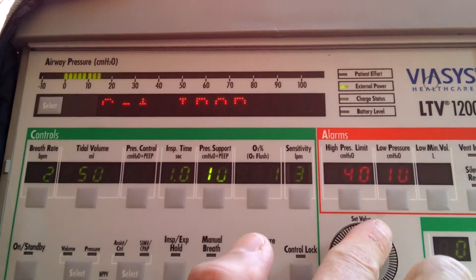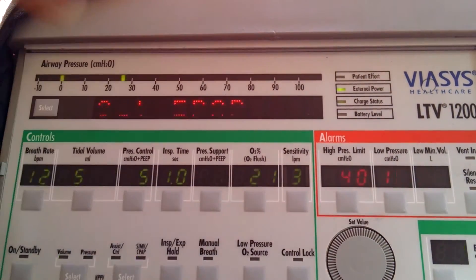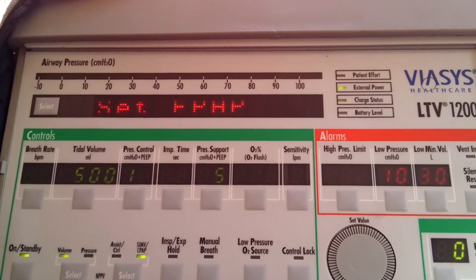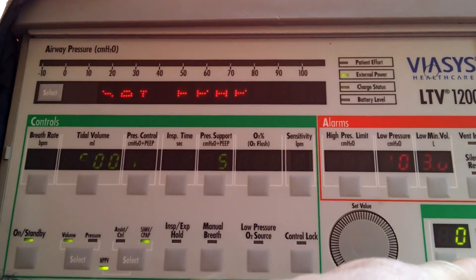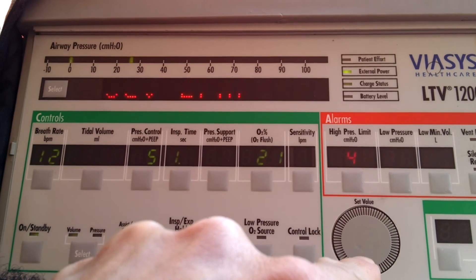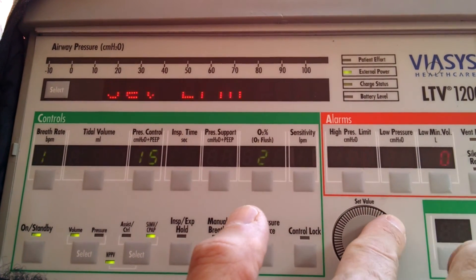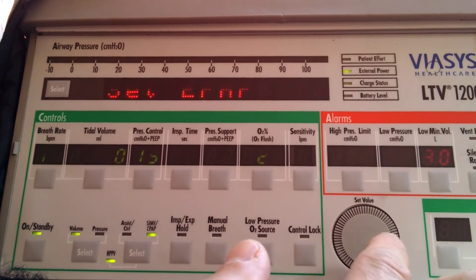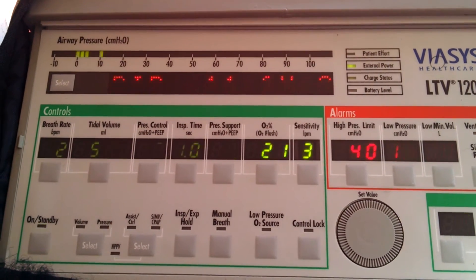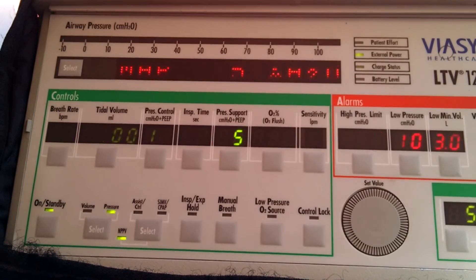We're going to come over here and take this down to 5, press that button and it accepts it. Now the ventilator is going to say 'Set EPAP' and the PEEP button is going to light up. We want 10 over 5, so we're going to set this to 5, then accept. Now the patient is placed on essentially BiPAP.